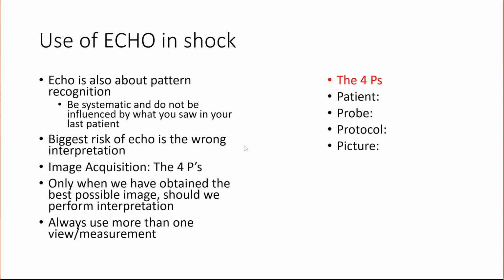Again, the echo is risk-free. It doesn't harm the patient, but wrong interpretation is the biggest risk. So be very wary of the wrong interpretation. The only way of getting competent is to do it again and again, and do it in a mentored fashion, or with somebody else doing QA on your images.